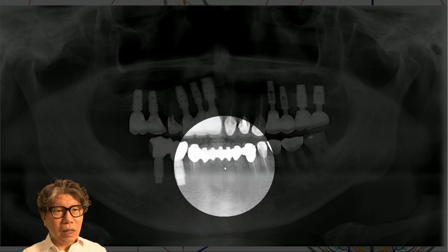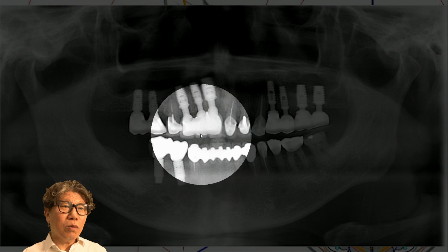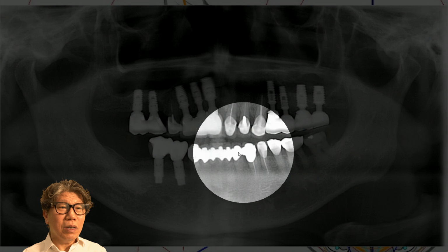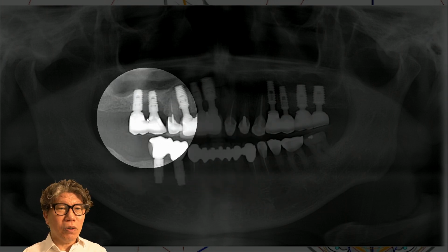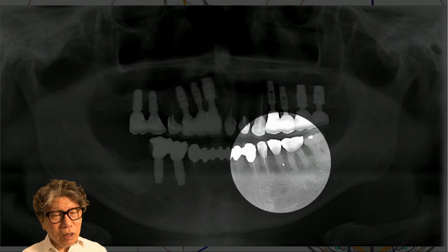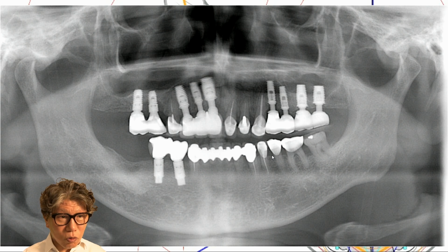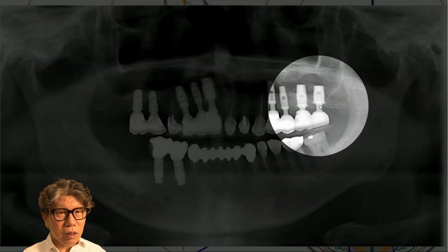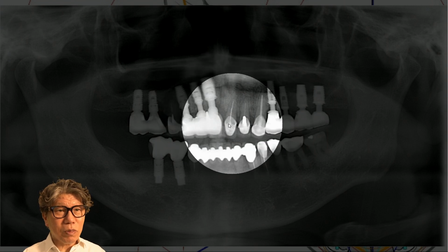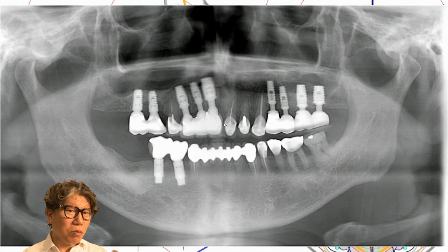And as you can see, elsewhere it's natural teeth versus implants, implant versus natural tooth. So, this side can be considered as the natural tooth yielding when occlusal force is applied, isn't it? However, this side cannot avoid each other. This is because it moves around 3 micrometer to 5 micrometer. In the case of natural teeth, I think they will move more than 100 micrometer here. Of course, since everything is bundled, I don't know what will happen, but here it will move 3 micrometer, 5 micrometer, and the same goes for here. Here it will move more than 100 micrometer again. It also moves especially. So, it is assumed that it can move laterally by almost 200 micrometer.